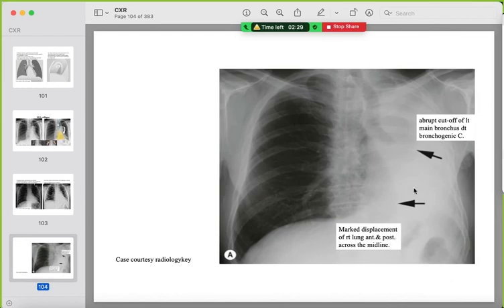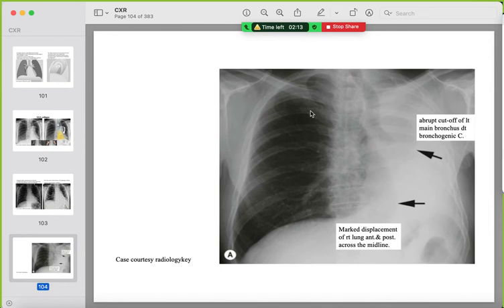Total left lung collapse: abrupt cut-off of the left main bronchus due to tumor, mediastinal shift ipsilateral to the left side, and the right lung is overinflated and even crosses the midline to compensate for the collapsed left lung.